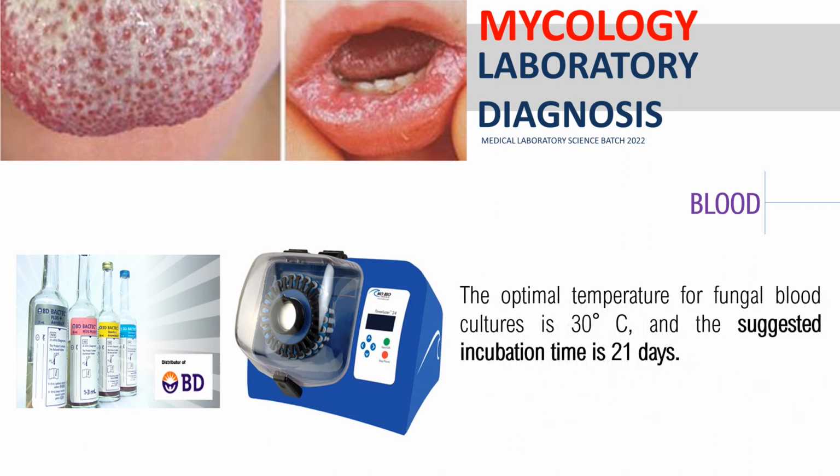So the optimal temperature for fungal blood culture, class, is 30 degrees Celsius, yung nabanggit ko kanina, and then suggested incubation time is 21 days. Ayan, hinighlight ko lang to, class, kasi for sure lalabas to sa exam.